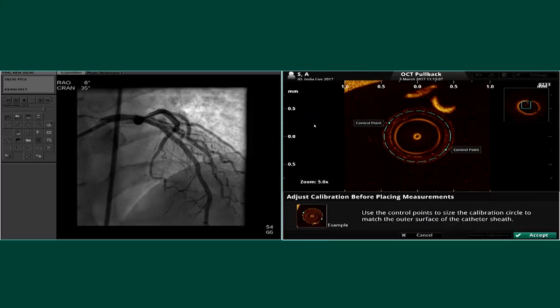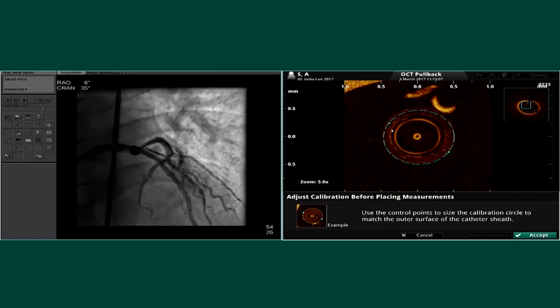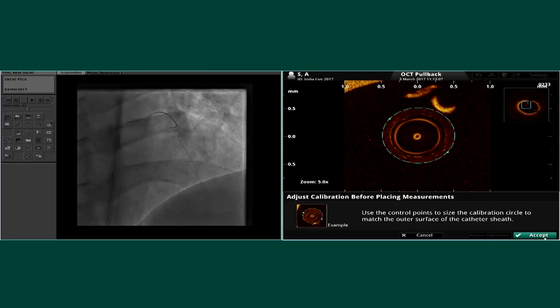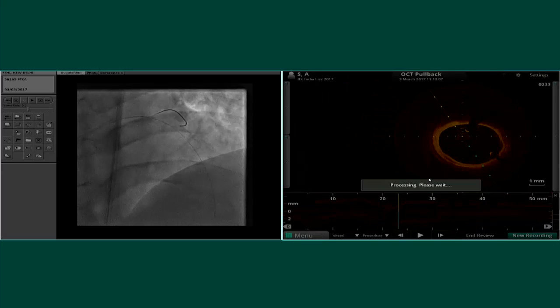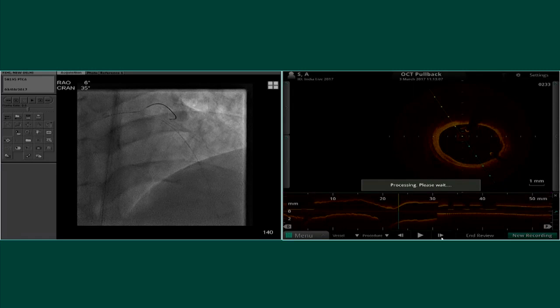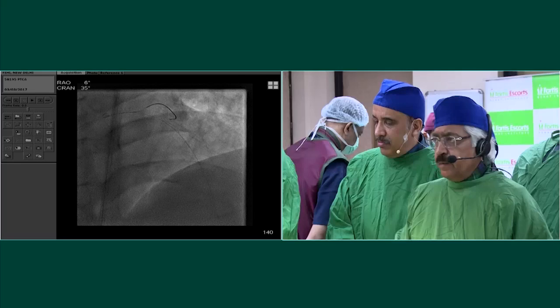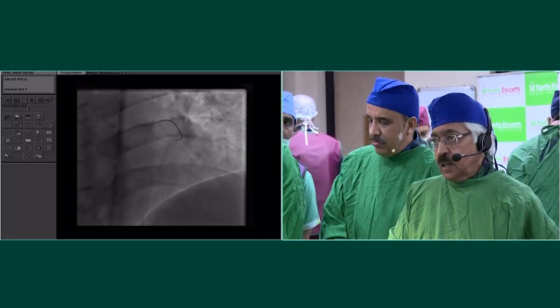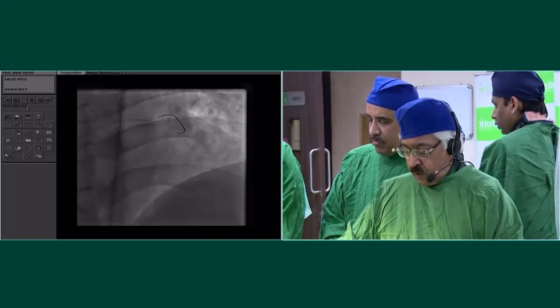Yeah, NC. For an apposition, could you take a 4 compliant? Yeah, we could take a 4 compliant because at the end we don't need NCs here. We could just do a compliant, okay? So you might take a 4 compliant and go up at least to 4.2. What you can do, Ashok, because there is one strut a little bit floating in the distal left main. Take a 4.5 millimeter balloon, low pressure, and it will be right.